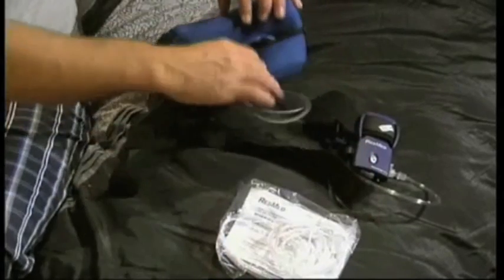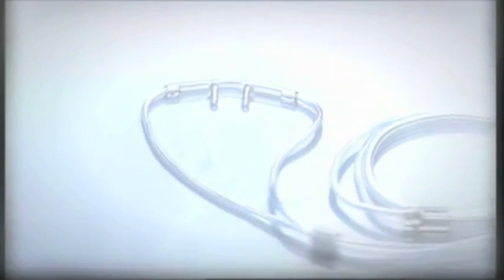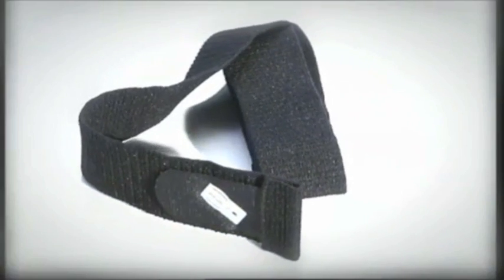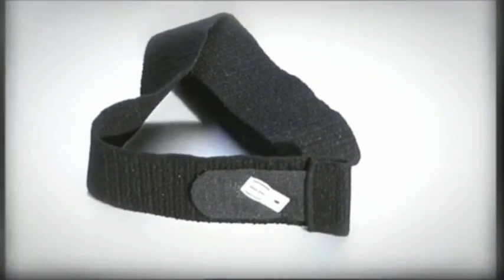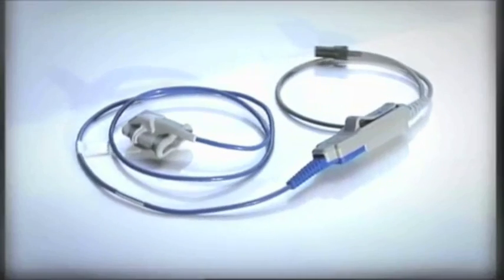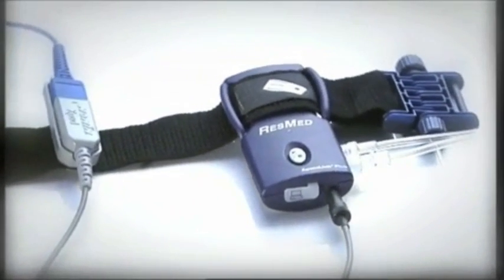Don't worry, it's simple and doesn't hurt at all. When you open the pack, you'll find several components. Some are disposable, like the nasal cannula. Other parts are reusable, including the belt, effort sensor, ApneaLink Plus recorder, and pulse oximeter. We'll explain each of these parts as we assemble the system.